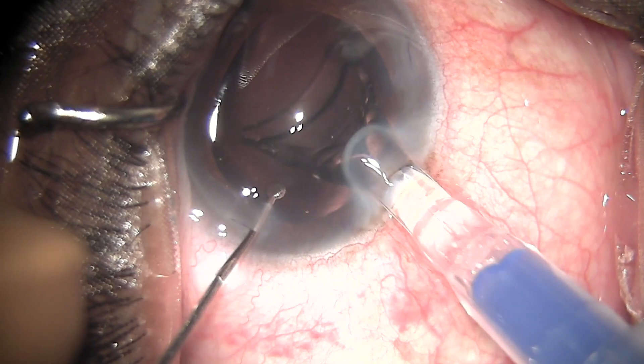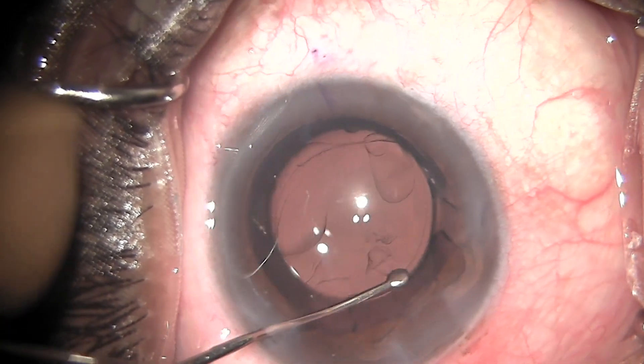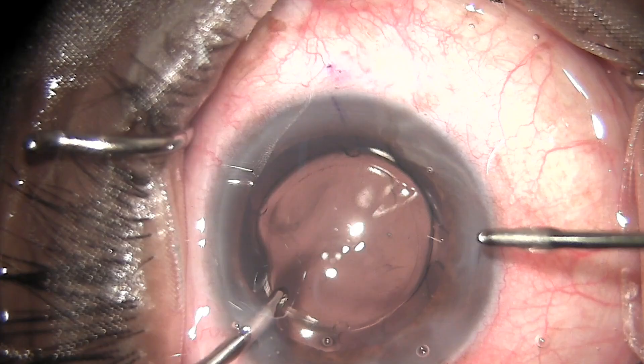The lens is being injected into the anterior chamber, which goes very easily, and the whole lens is placed into the bag in the first step.